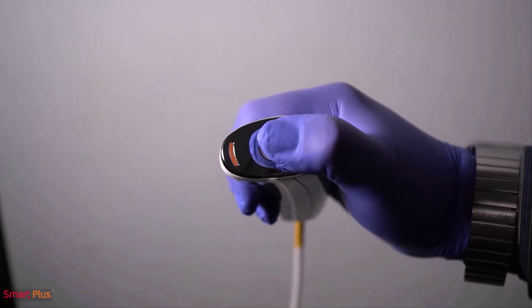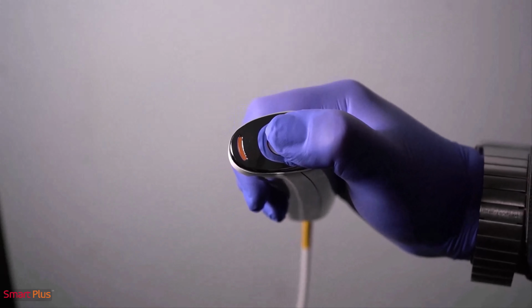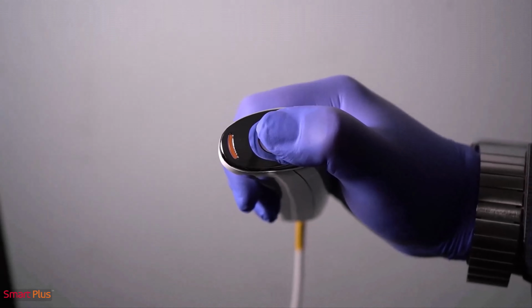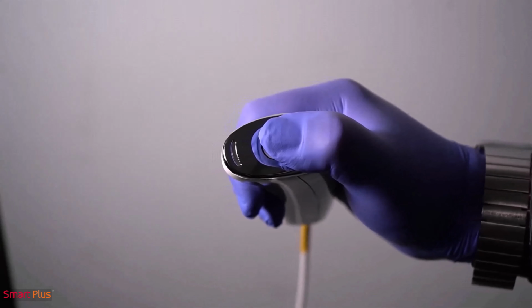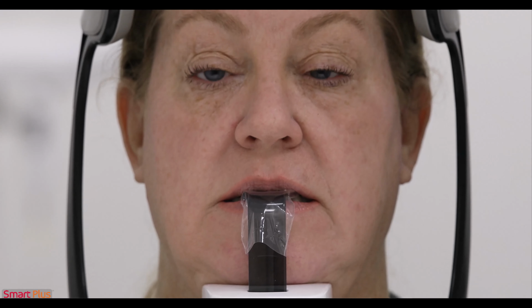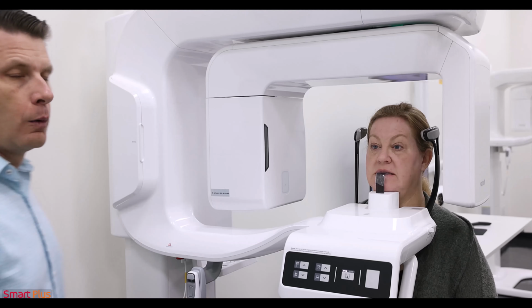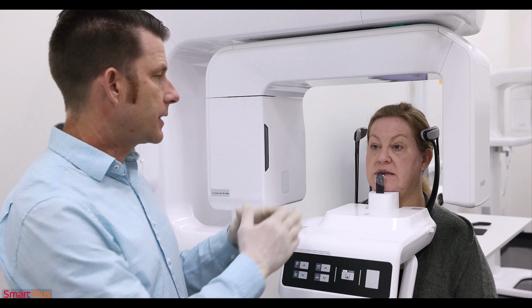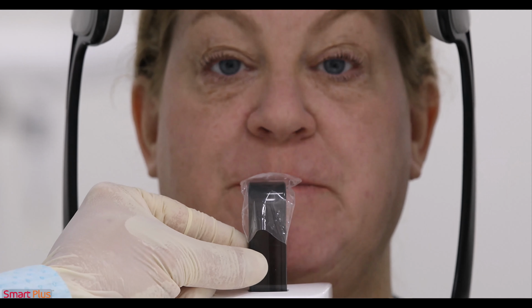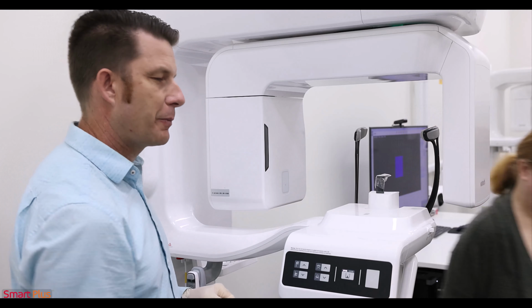Hold the button on the acquisition trigger switch, which will turn yellow and expose it. Hold the button until the image acquisition is fully complete. Please open your eyes and follow the operator's instructions. Once capture is complete, the temple supports open, and we can go ahead and let our patient out of the device. You can just go ahead and step over there.